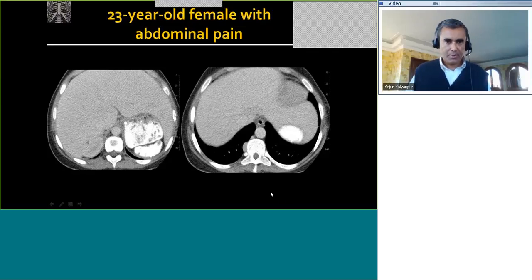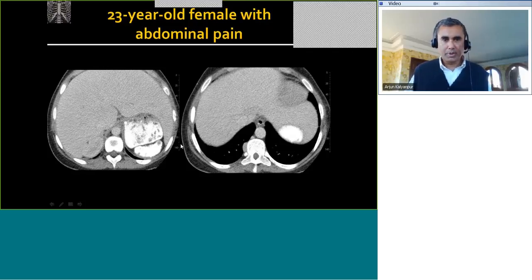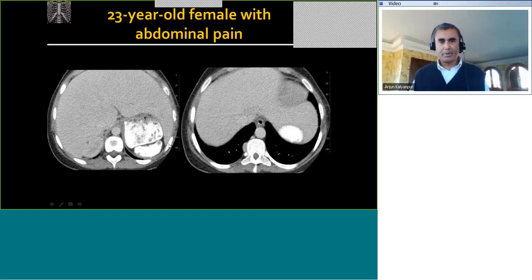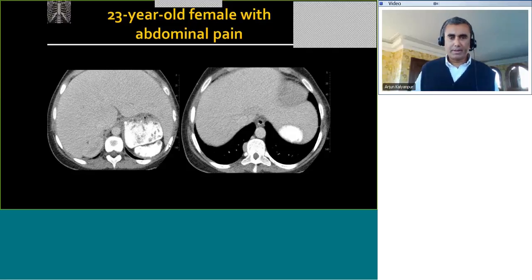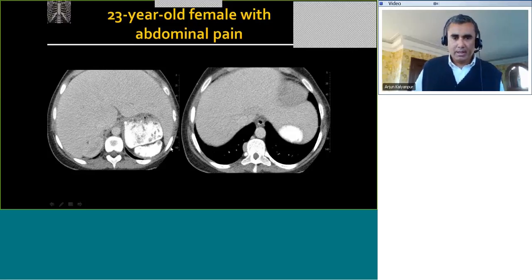In this case, the obvious finding is that if you look at the screen, there is a structure that is not part of the stomach — it is extremely dense, small in size, and irregular in contour. These are all features of what we call autosplenectomy, and the moment we hear that term we pretty much know the diagnosis: sickle cell anemia. Looking for additional findings, we see a small soft tissue density in the mediastinum — an example of extramedullary hematopoiesis in this patient.